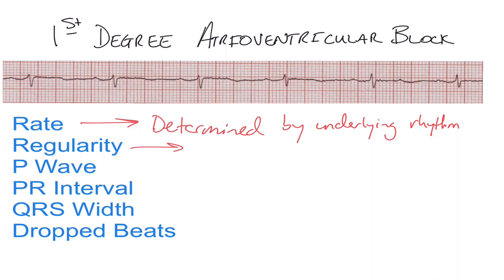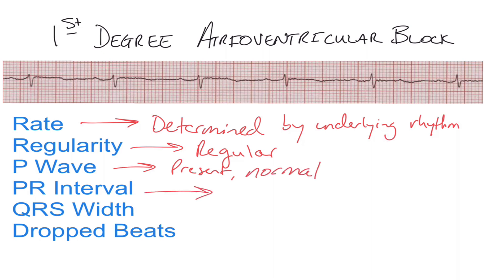It is a regular rhythm. The P waves are present and normal. The PR interval is elongated, which is the telltale sign that you're probably dealing with an AV block. The QRS width is normal as well.